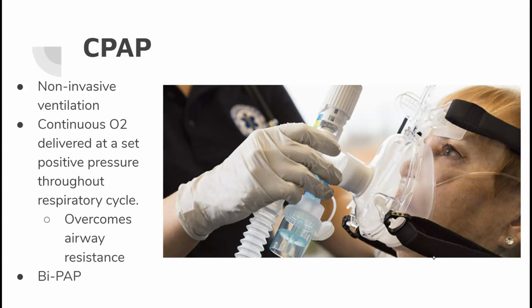How would you set up the inline? You could potentially put it right in between the mask and the valve. You'll get an okay reading, but it's not going to be super accurate because it's going to be significantly diluted by the amount of oxygen that's blowing through. So the closer to the patient, the better. I have done the setup that you're talking about, and it gives you a little bit of a reading, but your waveform is going to be kind of crap.